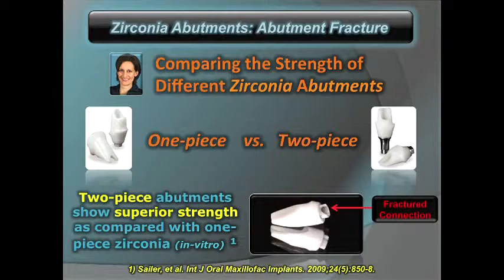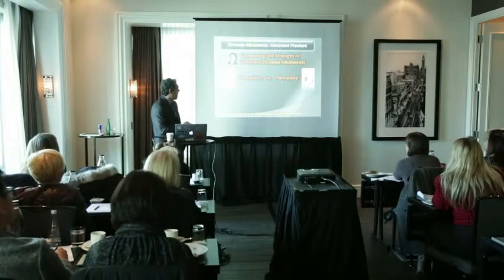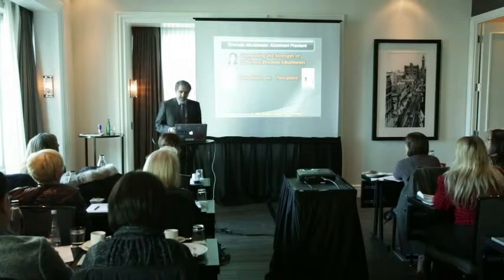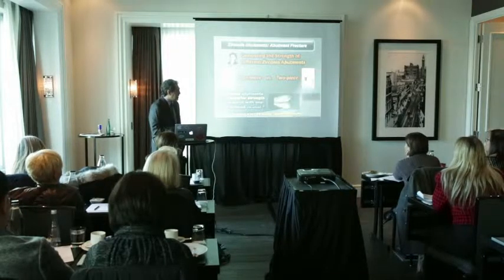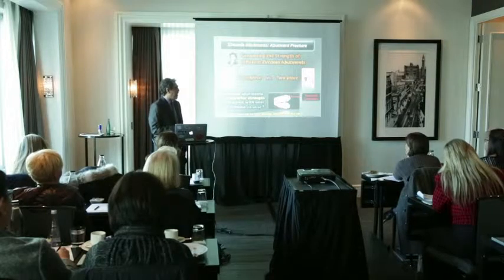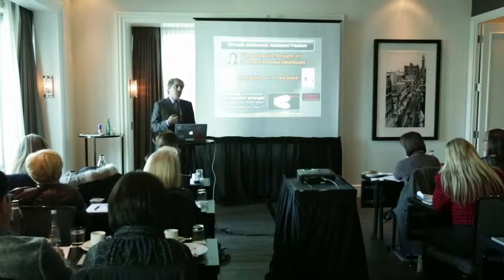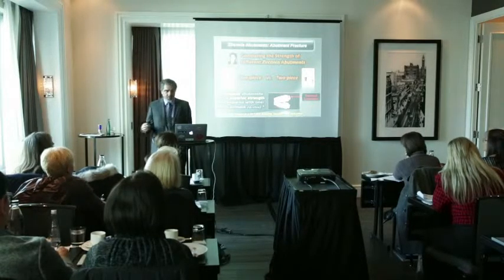As you can see here, this one has a metal base, the other one is all zirconia. In her study, she showed that two-piece zirconia abutments, which we sometimes call hybrid, would show superior strength as compared to one-piece zirconia abutments.